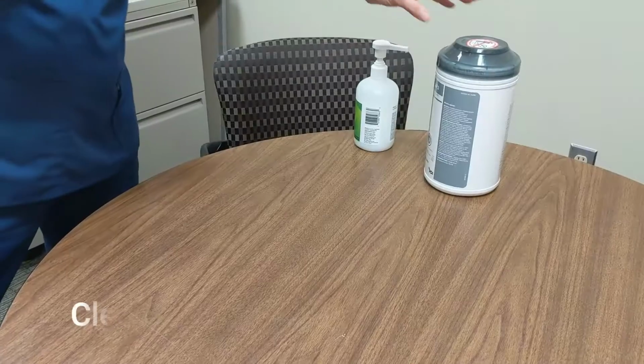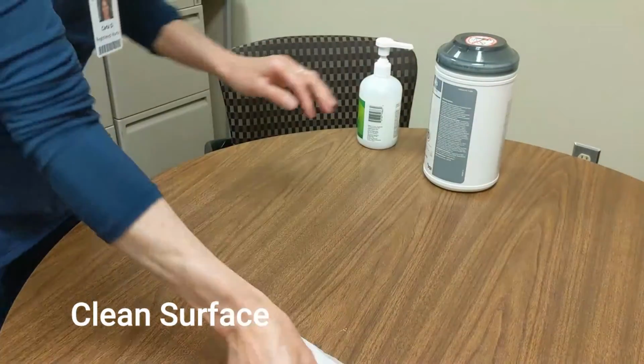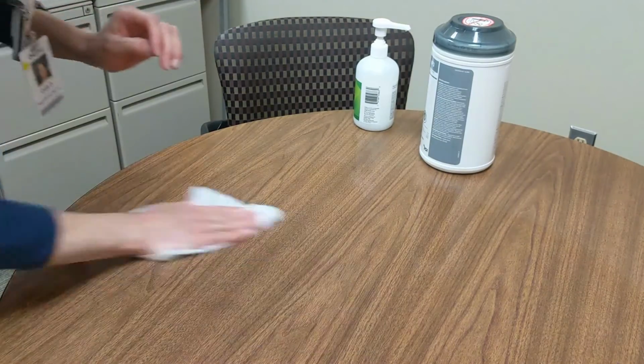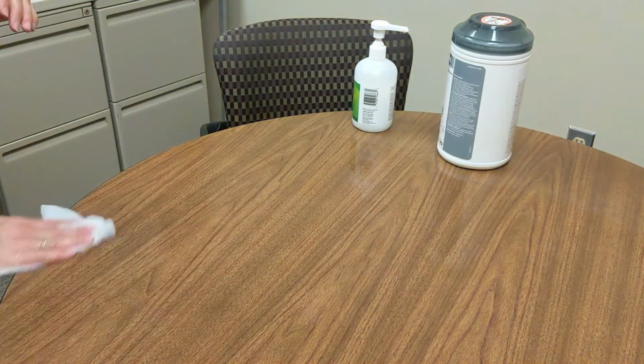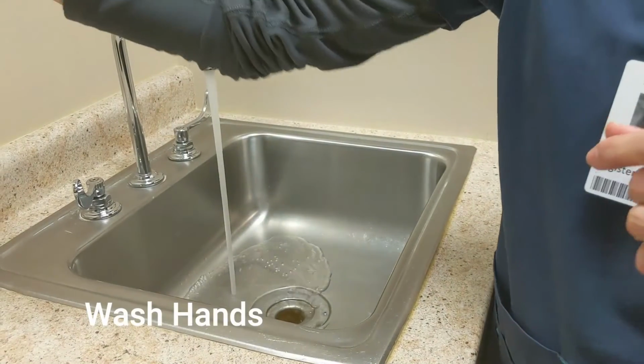Today we are going to learn how to give your IV antibiotic using the IV push method. Begin with a clean surface, washing the area with a clean hand towel with soap and water or a disinfectant wipe. You can also use your visual teaching mat as your work surface, but remember to clean and disinfect before each dose. Next, wash your hands well for at least 20 seconds.